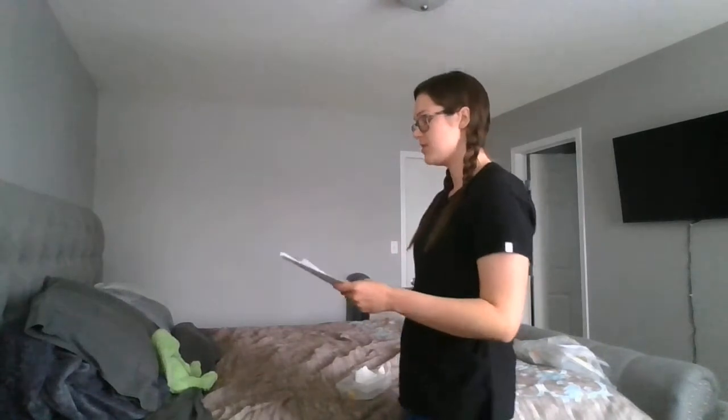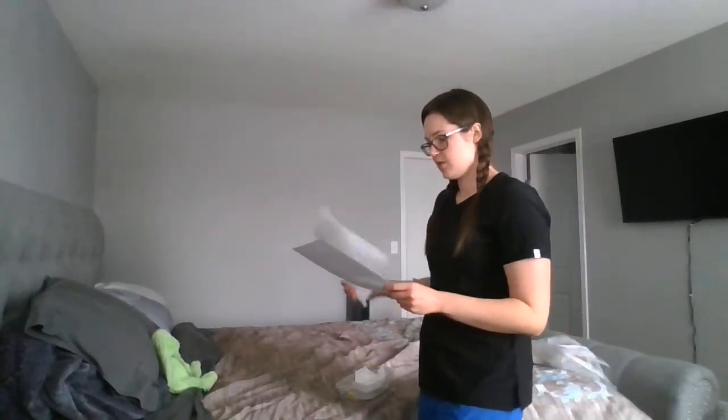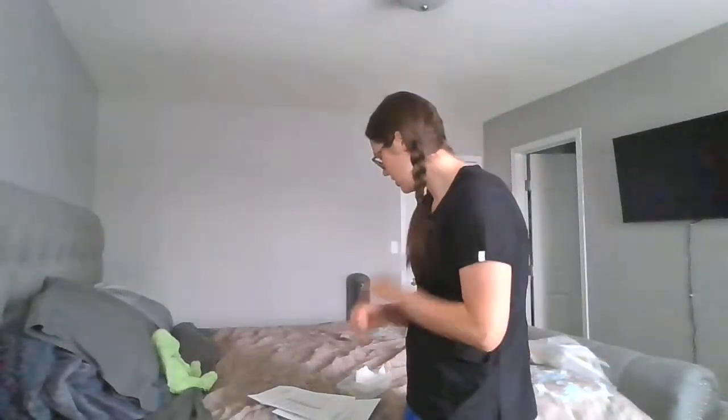So we go into our patient's room. We're going to introduce ourselves. Hello, my name is Monique. I'll be your nurse this morning. We're going to provide privacy, closing all the curtains, and make sure doors are closed and they're comfortable. Okay, I'm going to go ahead and perform hand hygiene. So wash thoroughly in between fingers, then gloves.